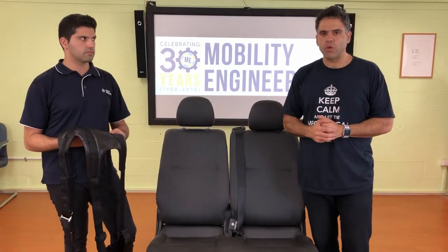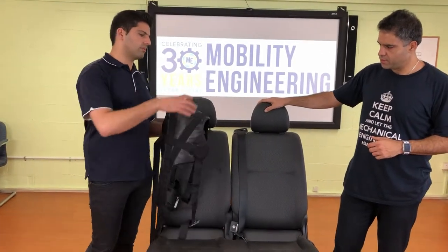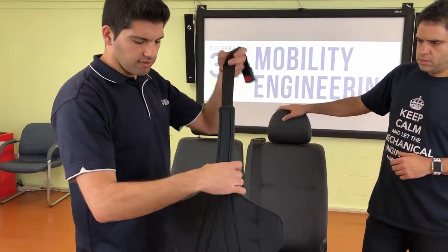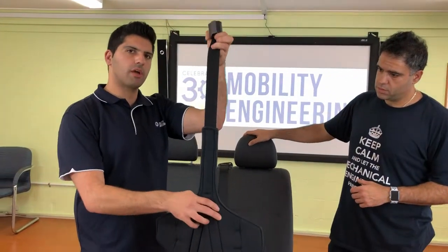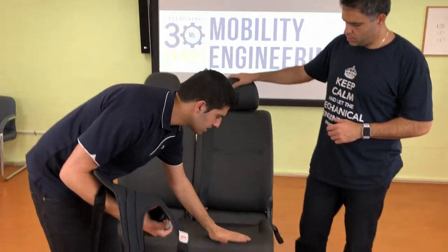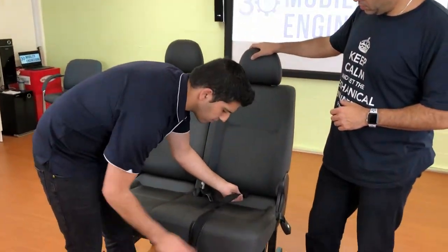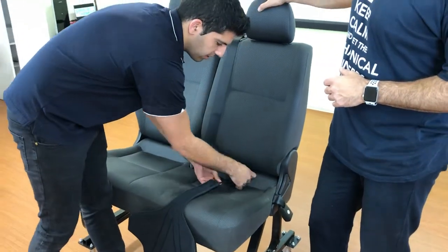The first step for installing this harness: the occupant will not be sitting in the seat yet, as we have to install the harness prior to the occupant being seated. The five-point harness, when reversed, looks like this. The strap in my left hand is the crutch strap, which we first feed through the gap between the squab and the back of the seat. You open the harness, place it onto the front of the seat, and feed the buckle through that gap.